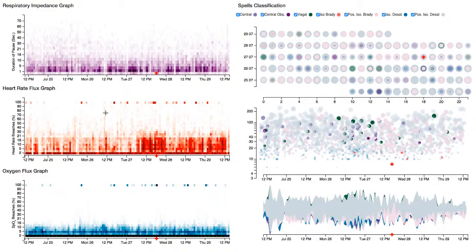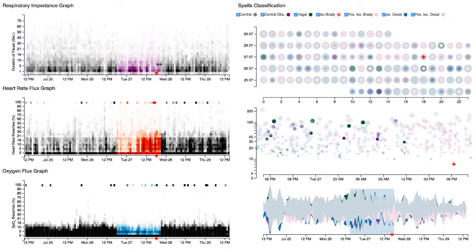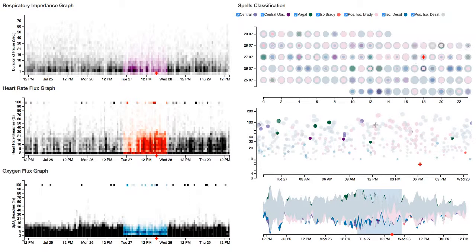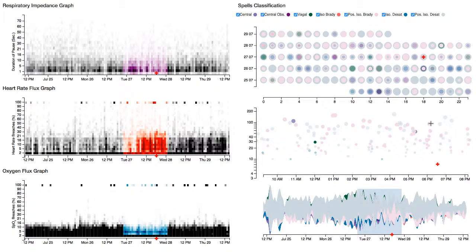PhysioX also allows the analyst to perform interactive coordinated brushing to highlight regions of interest across all charts. Here you see that the analyst has highlighted 24 hours prior to the suspicion of infection. The respiratory impedance graph shows not very many events. The heart rate flux graph shows some highly fluctuating events. The analyst then moves on to the sequence graph to see the events that occurred prior to the suspicion point, then moves to the linear graph and zooms in on the regions just before the point of suspicion to get deeper insight into the events that occur.